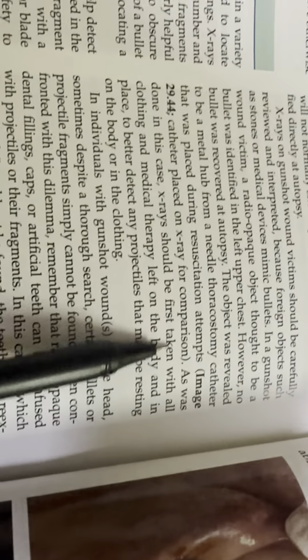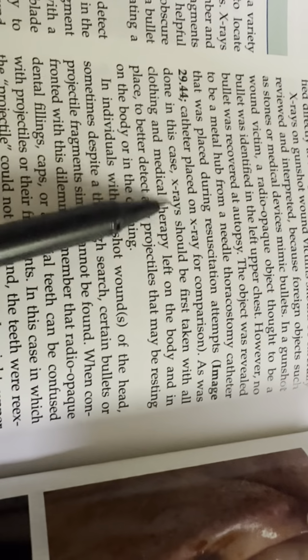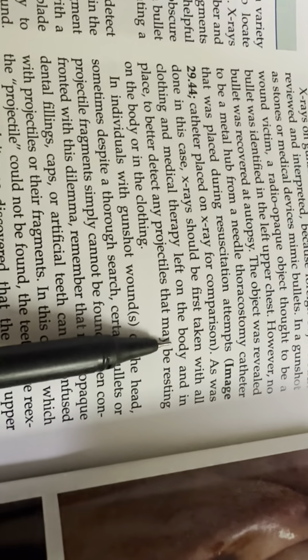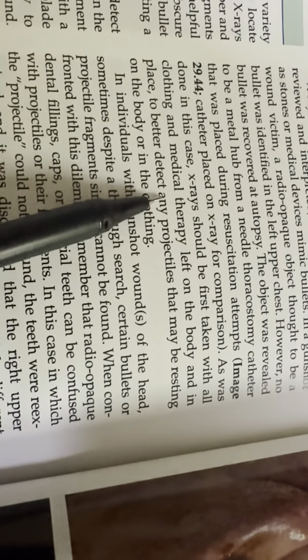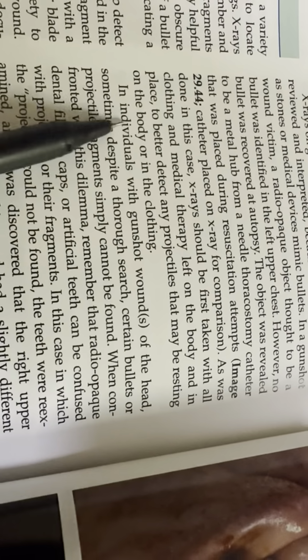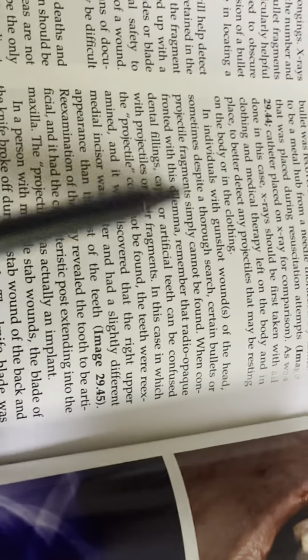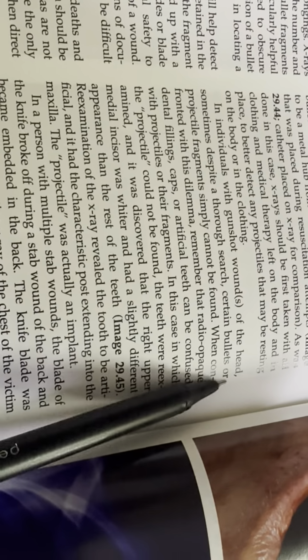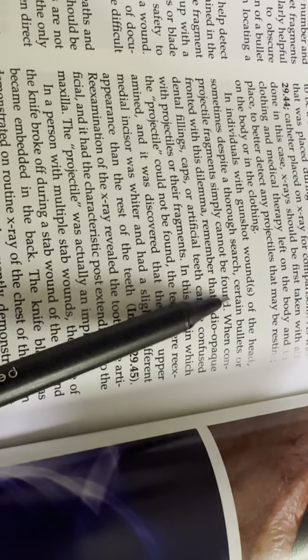The catheter was placed on X-ray for comparison. As was done in this case, X-rays should first be taken with all clothing and medical therapy left on the body, in order to better detect any projectile that may be resting on the body or in the clothing. In an individual with a gunshot wound of the head, sometimes, despite a thorough search, certain bullets or projectile fragments simply cannot be found.